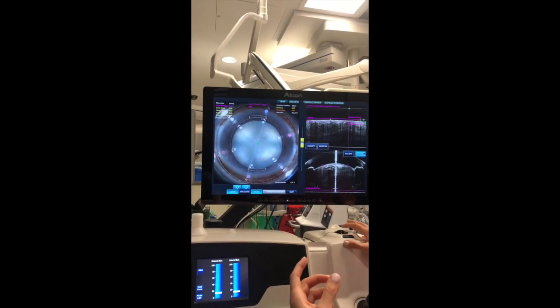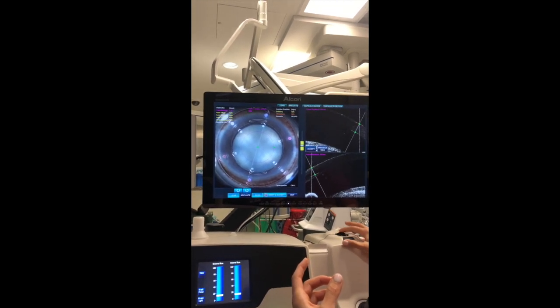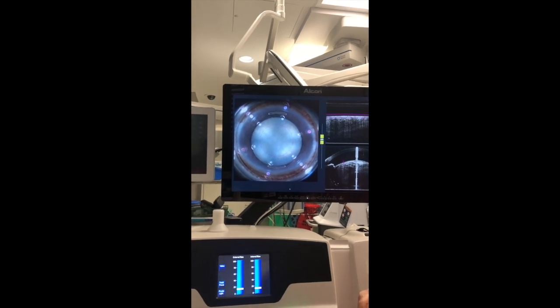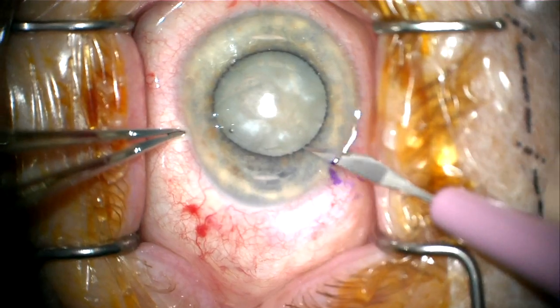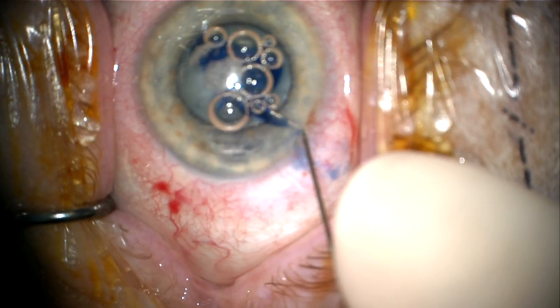Some things we've tried in the past is using a highly cohesive viscoelastic, doing a snail track or a phaco-rexis, depressurizing the intralenticular compartment. But I have found that using femtosecond laser-assisted cataract surgery in these cases to be extremely helpful. The femtosecond creates the capsular button in approximately 2 to 4 seconds with the LenSx system from Alcon.